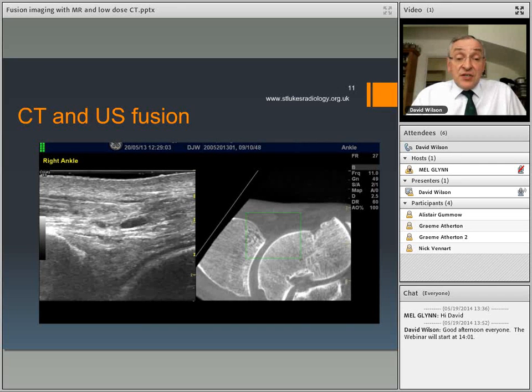The articular surface of the talus is seen as a black line, and this fat pad, triangular fat pad sitting inside the joint. The ultrasound proves to us there is no joint effusion. It allows us to look at neovascularity, but we can see the depth of the joint and the osseous structures. In the case of, say, ankle trauma, as we were looking at earlier, we can see the fractures using the CT examination.